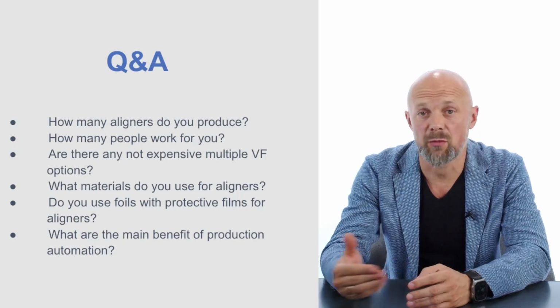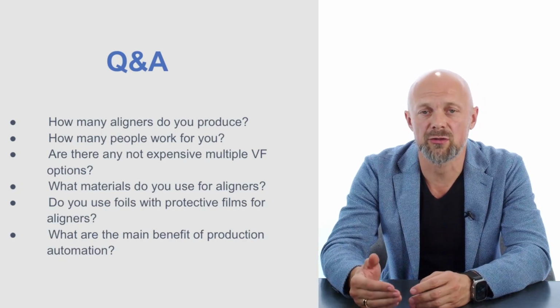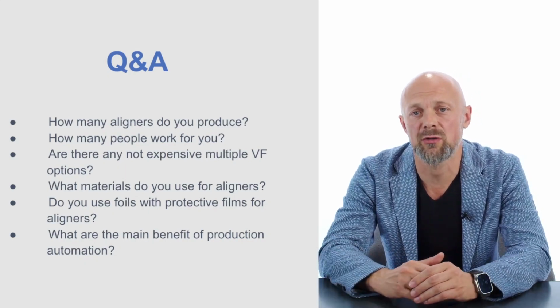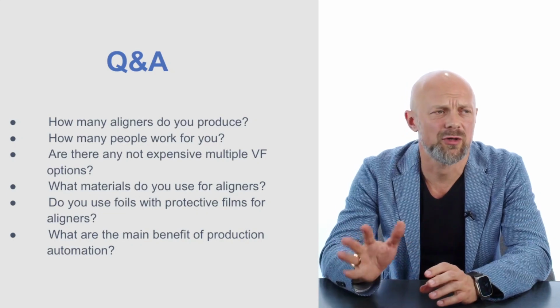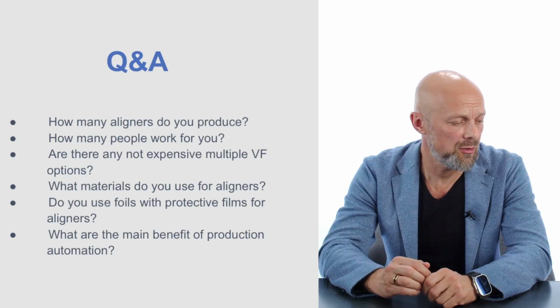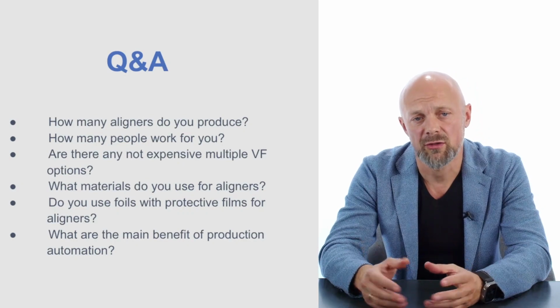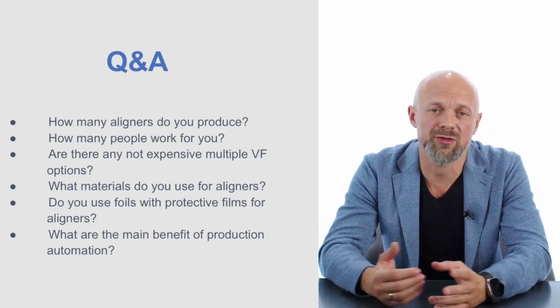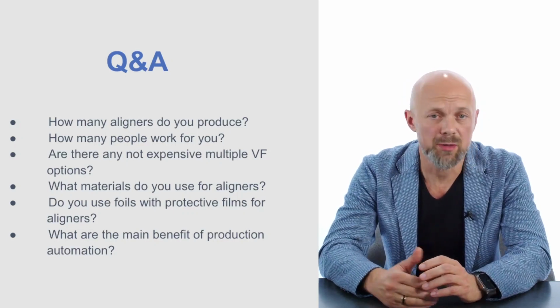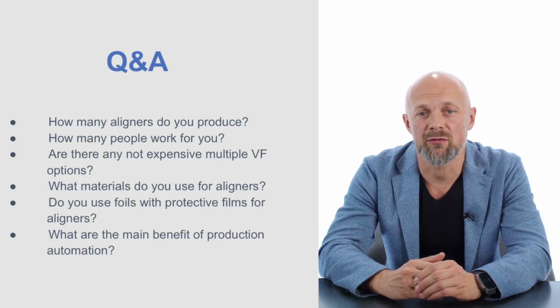So it's good because compared with B Pro, Dreve V9 uses unique foil bodies, which are pretty big square foils, roughly 300 millimeters by 300 millimeters. So if you use V9 by Dreve, you definitely must use only Dreve foils, which is not good, I think. B Pro is more universal. You can use rounded foils from any vendors.